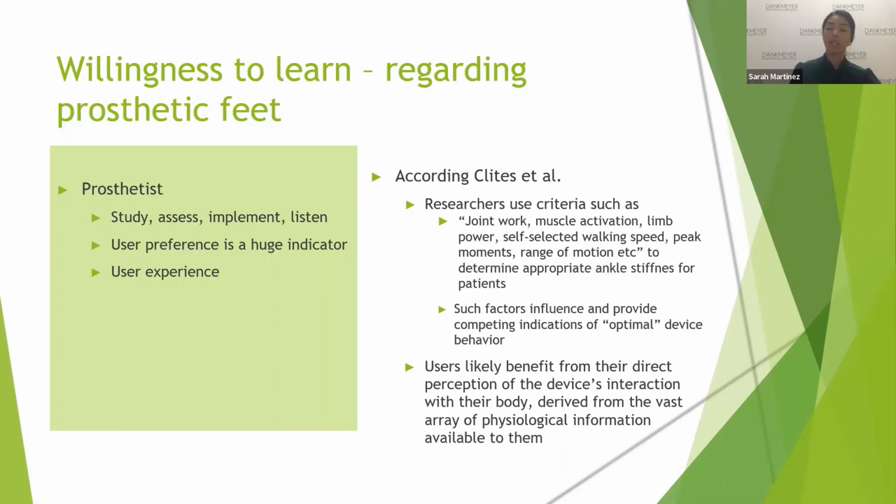So I've had patients that are athletes and they just take off and they're walking and they're doing a great job. I've had patients who aren't athletes do the same thing. They just have a really good understanding of body awareness and proprioception. So it's an important reminder that even though as prosthetists, we historically have known this foot to work well for a certain patient presentation, it's up to the patient to let us know how the foot is working for them, and whether our alignment needs to change. Things like that factor into the equation.